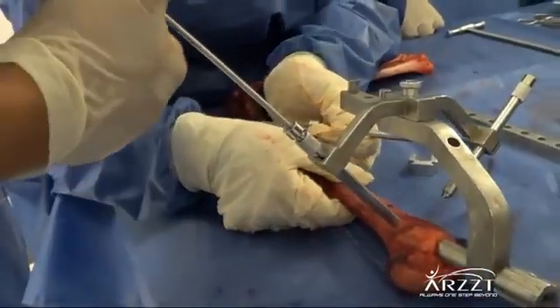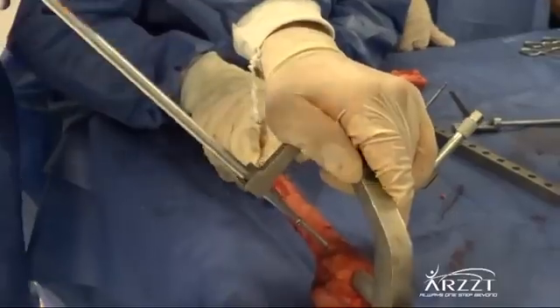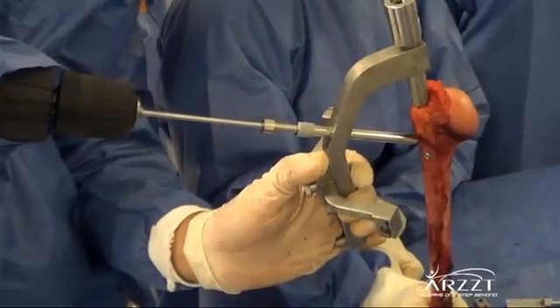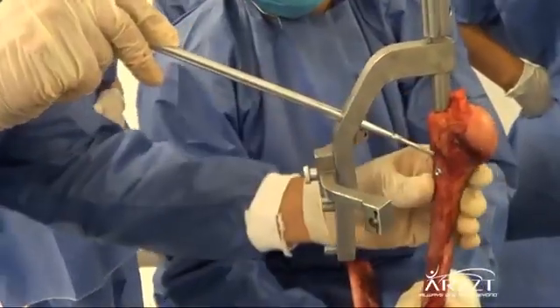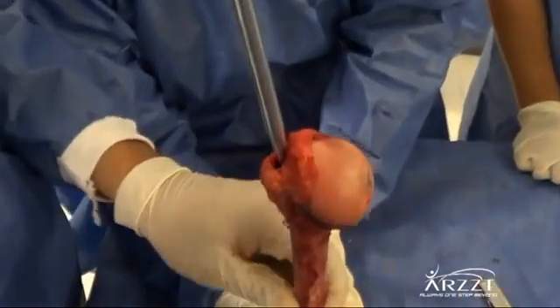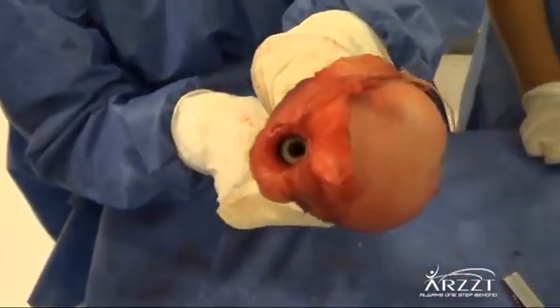The same steps that were performed for location, drilling and blocking used for distal holes, the proper length screws are inserted. The nail clamp is removed. The closure cap is inserted. The fascia is sutured with Vicryl 2.0 and the skin with nylon 3.0, depending on the orthopedic surgeon's preferences.